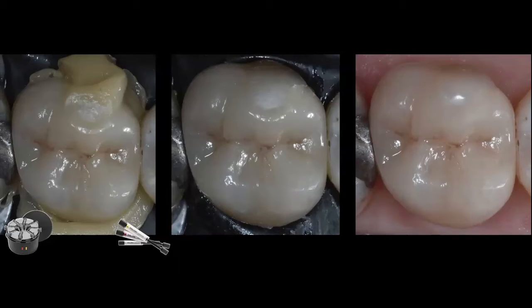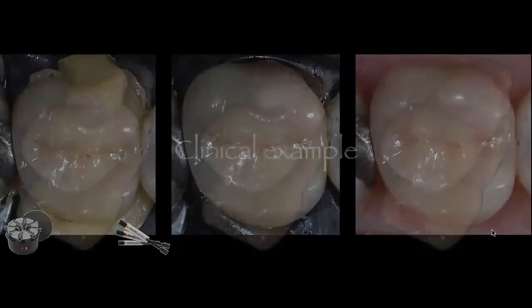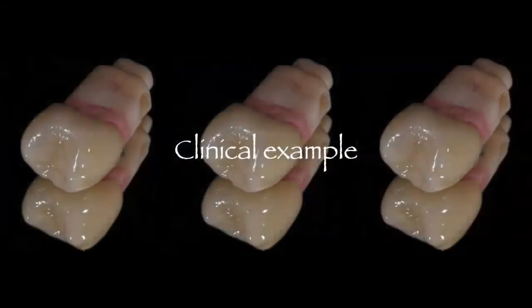So I do 30 buccal, 30 occlusal, 30 lingual, and then I come back to the buccal, 30 more occlusal, 30 more lingual, and then I just start cleaning, removing the excess, remove the rubber dam, adjust the occlusion, polish my final restoration, and what you're seeing on the far right hand side of the screen is the completed restoration. So again, this makes it a lot easier. You just have to give it a try, but keep in mind that spacer, the die spacer thickness that you are required to request from your lab in order for this to happen without any issues.